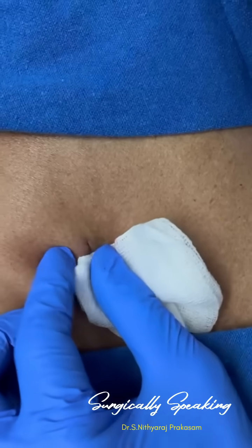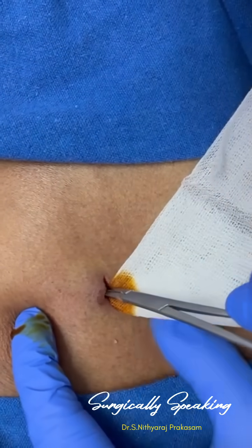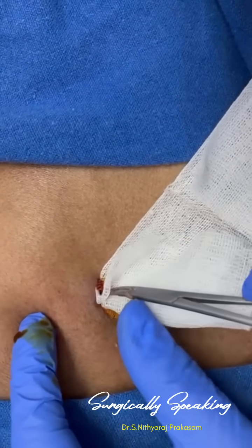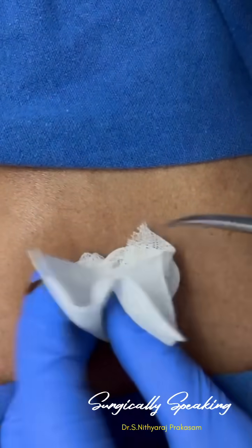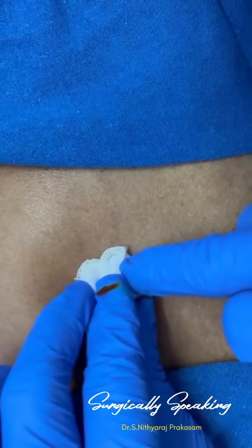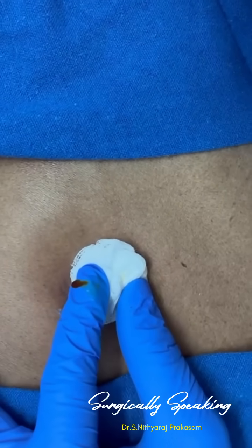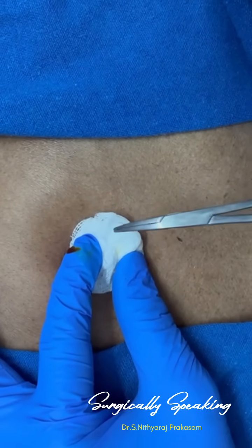I'll just put a dressing there, one more gauze. And give me some betadine. A little bit of betadine there. That will serve as a wick drain. And I'm going to dress it up. This patient will be coming to me regularly for dressings. And after this wound is healed and all the infection has settled down, maybe after a couple of months, I will do a definitive excision of the sebaceous cyst along with the capsule.